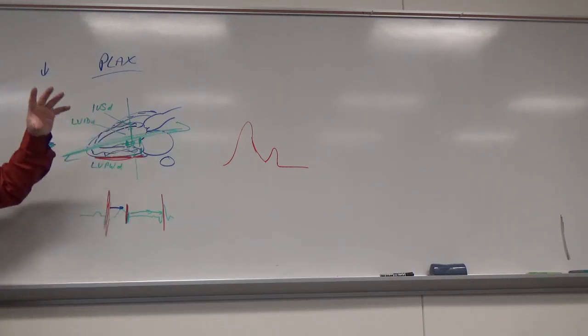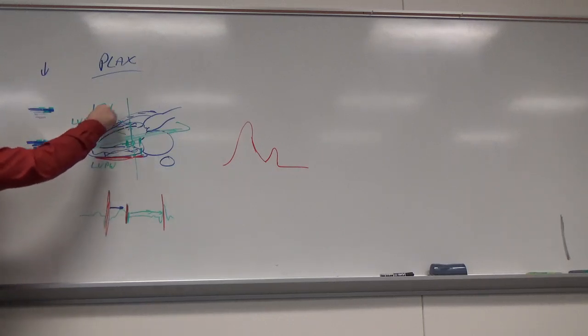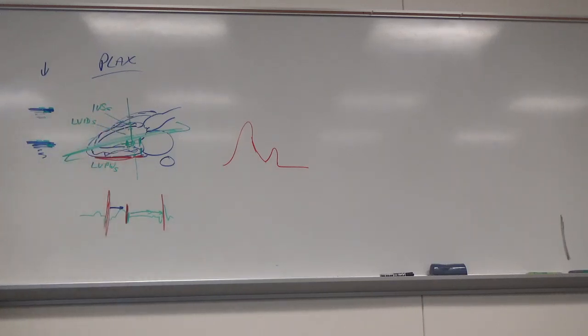End of systole, I go in until the walls are squeezed down as much as they can, and then it starts going out, and then I scroll back until it's at that thinnest, smallest volume. So at the end of the T wave is where that's going to be. You could either line it up to the T wave, or you can just do it visually like I do, and Tammy does also. So it's all the same measurements now, except instead of little d, it's little s for systole. You're measuring both walls. You're going to measure the diameter of the chamber as well.